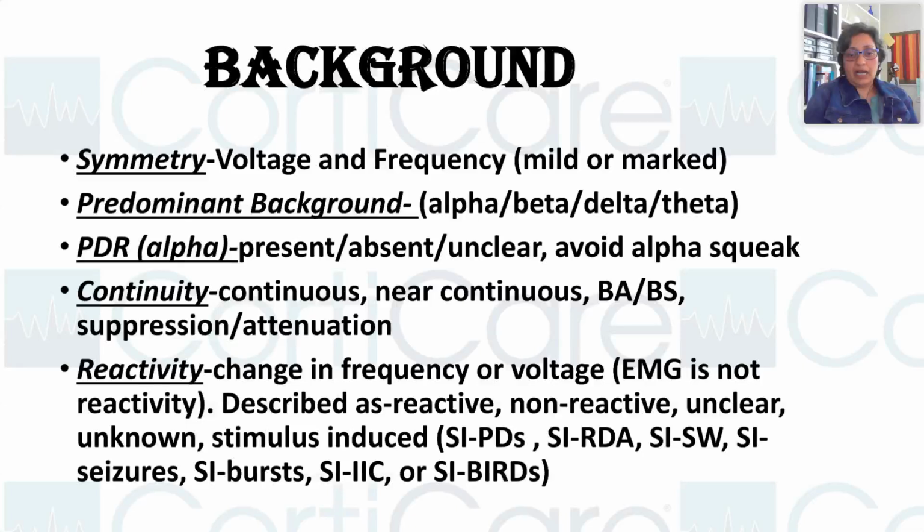Now the reactivity. I am not going to involve the reactivity patterns in this presentation. When you talk reactivity, there is change in frequency and or voltage, and in some instances, morphology of the background, of the pattern that we are seeing. So you describe whether the pattern is reactive, non-reactive, unclear, or maybe unknown. The patient is in the same position for the last 4 hours throughout your shift, and you just don't know if the pattern was ever reactive or not.